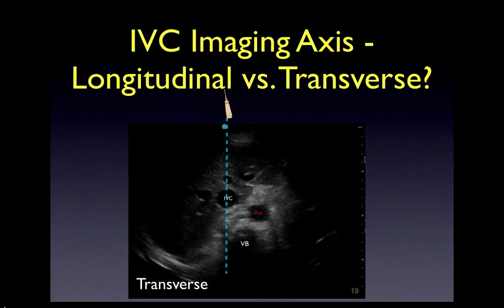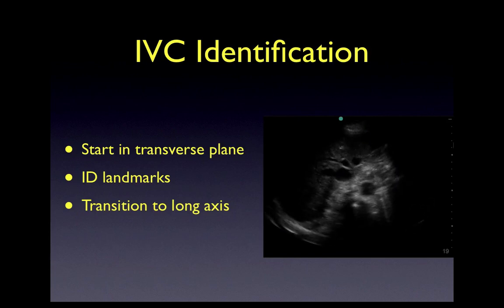As you can see, both the longitudinal and the transverse axis offer unique advantages over one another, so I would actually recommend visualizing the IVC in both planes, which after a little practice takes no more than a few extra seconds. This is an extremely important slide.